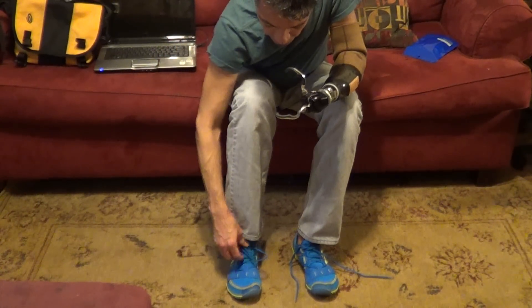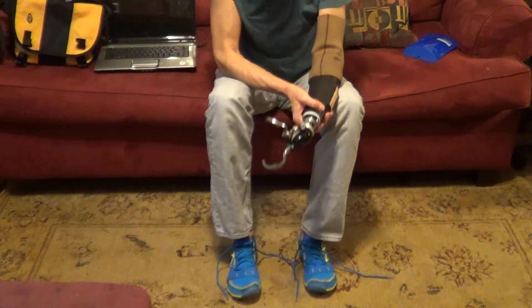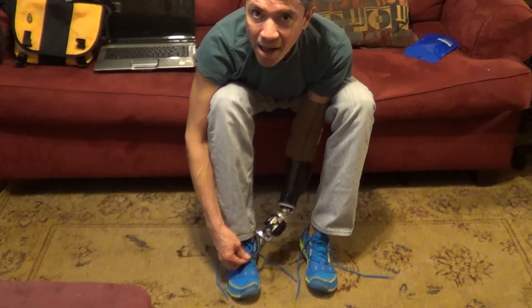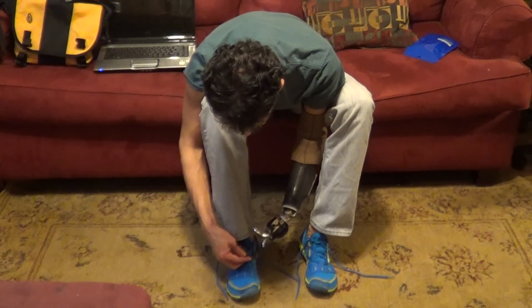Let me untie this shoe. Okay, when I go down, I'm having the problem here. I've got like some kind of mental block or something, or my muscles are tired.